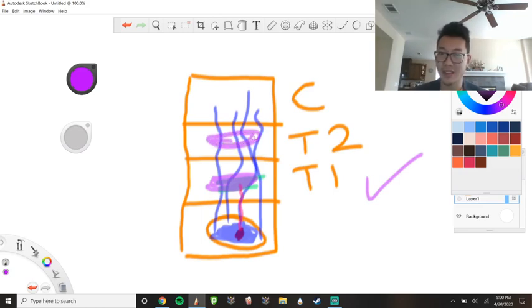But yeah, they're going to change colors because the two pieces, the blood with your antibodies and the virus chunks that are smeared on there, the antigens, are mixing and binding, and we've attached some probes so the colors change. If these both light up, it's very, very likely that you're positive for coronavirus.